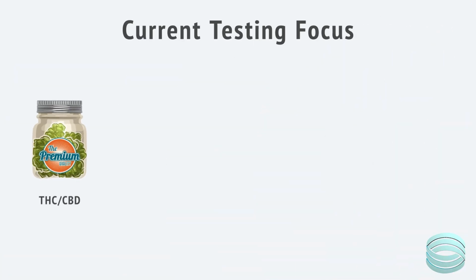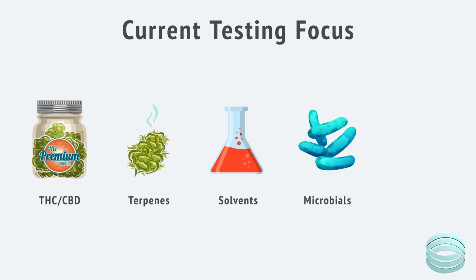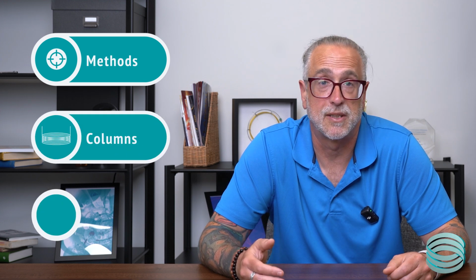Most cannabis testing today is focused on what regulators currently require: THC and CBD content, terpene profiles, residual solvents, microbial contaminants, and a defined list of pesticides. These are important, but they only cover part of the risk picture. Nitrosamines aren't part of the standard compliance panels in most labs. They're not being looked for, and in many cases, labs haven't developed the specialized methods needed to detect them. That's partly because regulations haven't addressed the issue yet. Cannabis regulations have moved quickly, but safety limits, especially for inhaled products, haven't kept pace. And while nitrosamines can be measured using GCMS or LCMS, doing it reliably takes carefully optimized methods, specific column choices, and rigorous calibration. It's not something you can bolt onto a routine screening workflow. Now, that doesn't mean the risk isn't there. It just means it's not being tracked.